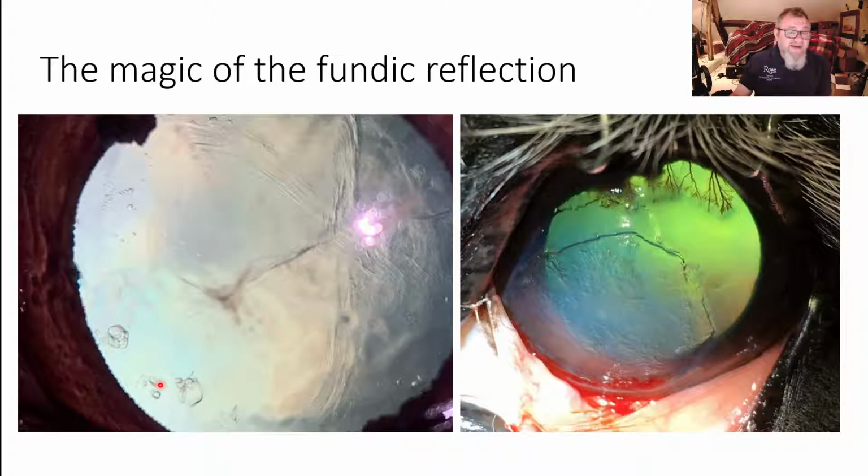And these lens vacuoles, particularly when they're in the equator of the lens, are worrying, as they may be a sign of progression of cataract. The right-hand image shows a patient who's had a corneal surgery. We've removed an area of superficial cornea here, called a superficial keratectomy.